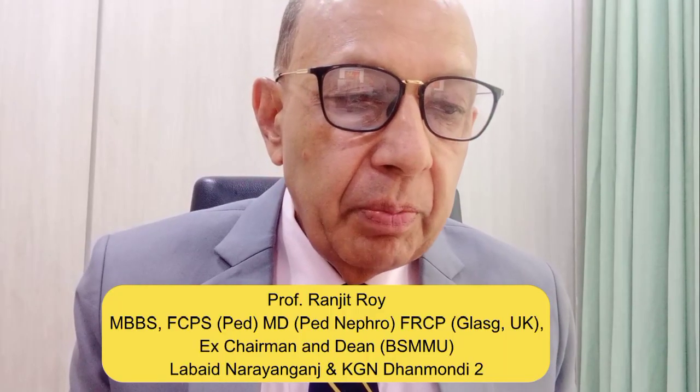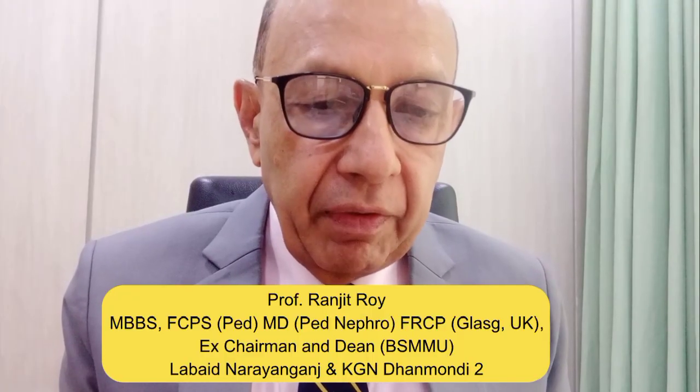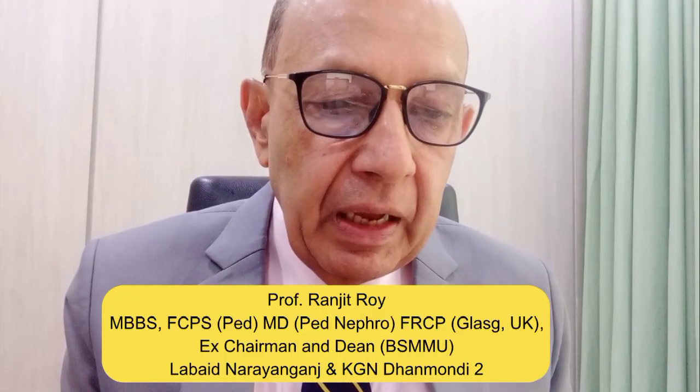Lumbar puncture and your CSF examination. It's an important step, an important invasive procedure, a little bit invasive, but don't be afraid of it. Why do you do it? For meningitis, encephalitis, tubercular meningitis, and a few more leukodystrophy diseases, you need to do it. On an emergency basis, you need to do it for bacterial meningitis mostly. And some demyelinating diseases, you need it at times, a good amount of the time.